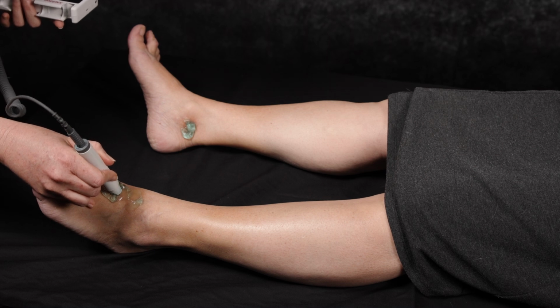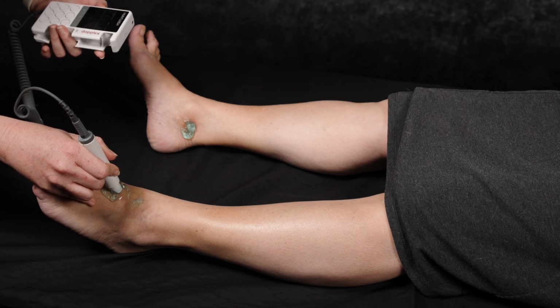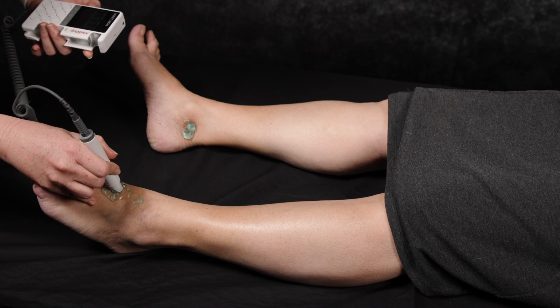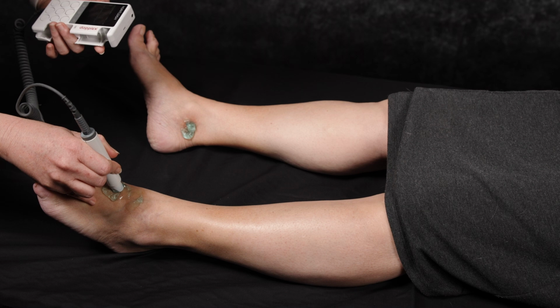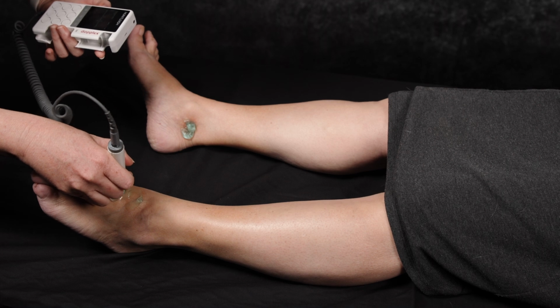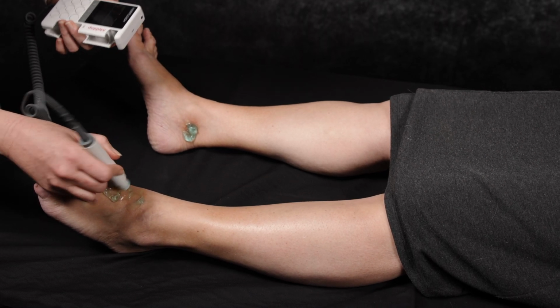It can be just very small movements. I've got a triphasic signal, so 3 sounds, which is ideal. It's very easy to make a good waveform sound bad with poor technique, so it's very important to get those angles correct.